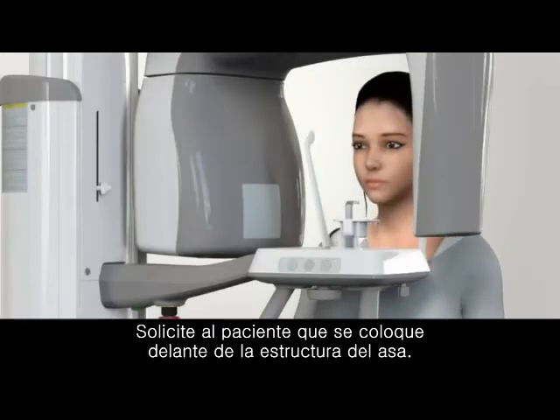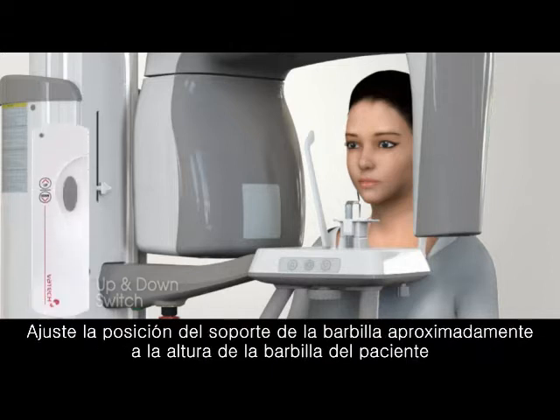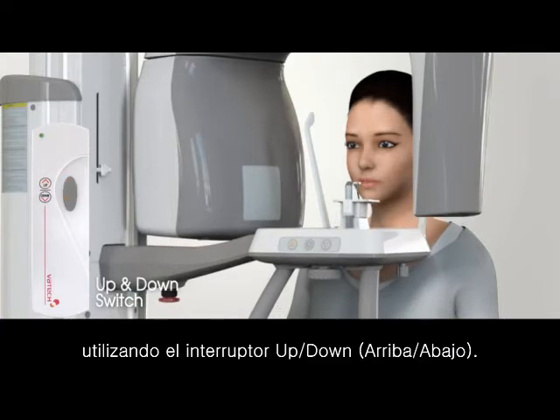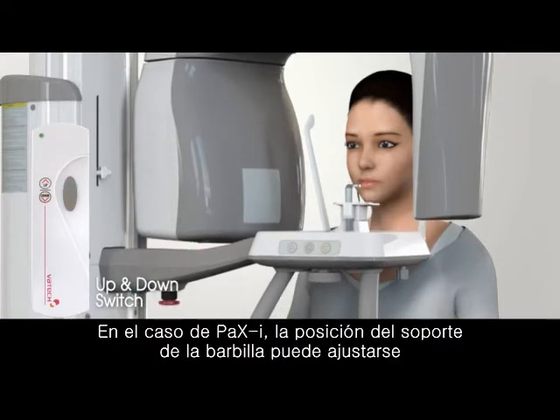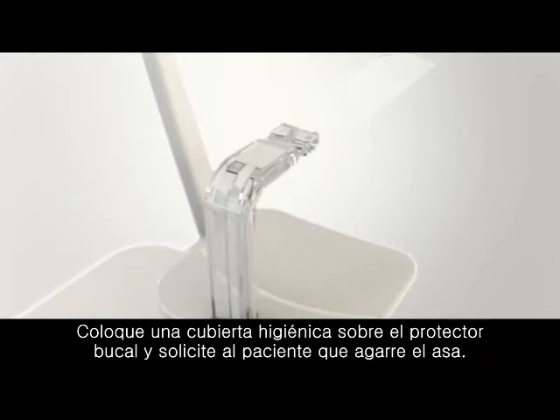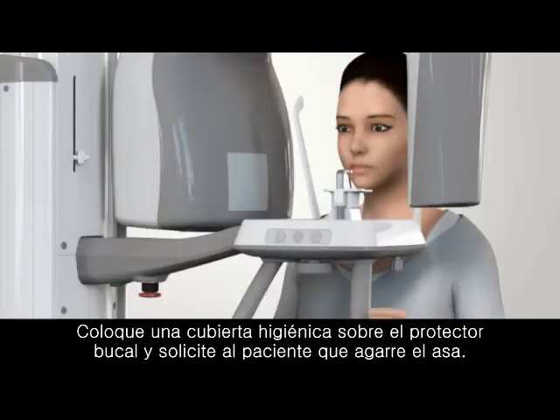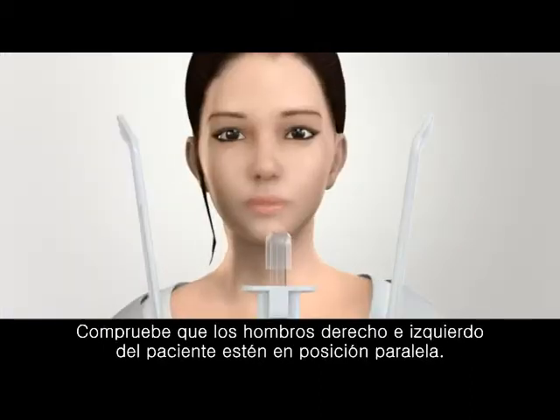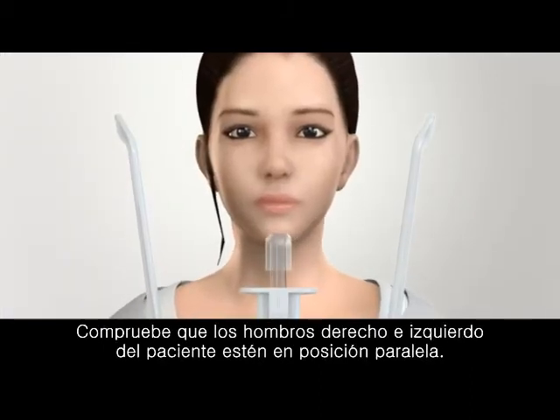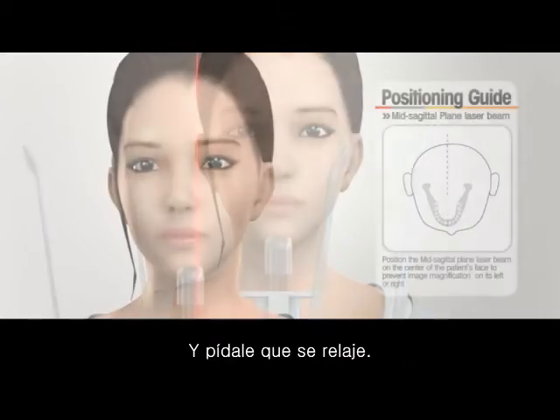Ask the patient to stand in front of the handle frame. Adjust the chin rest position approximately to the height of the patient's chin using the up-down switch. For PaX-i, the chin rest position can be adjusted using the up-down switch on the handle frame. Place a hygienic cover over the bite block and ask the patient to grasp the handle. Confirm the patient's right and left shoulders are parallel and lead the patient to relax.